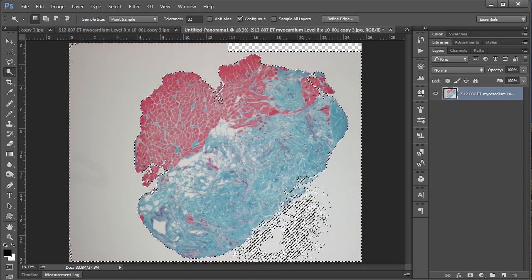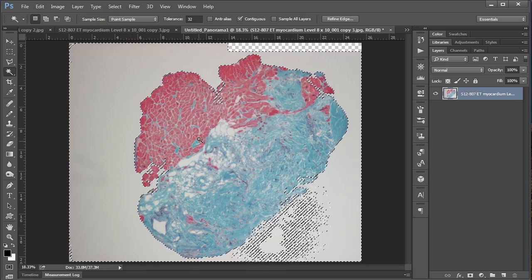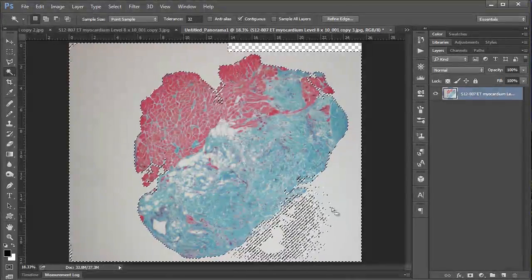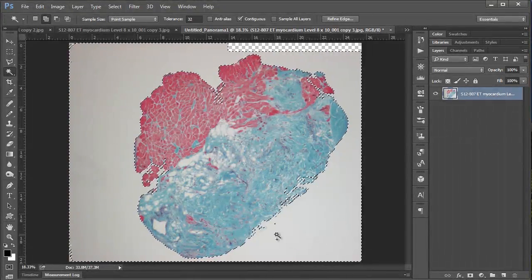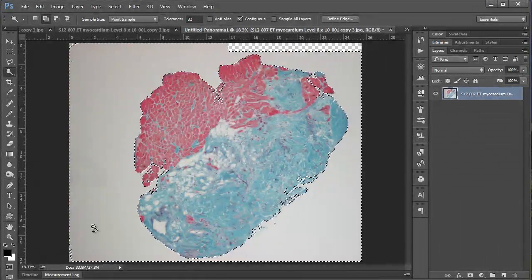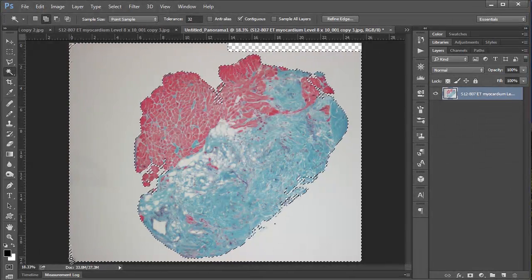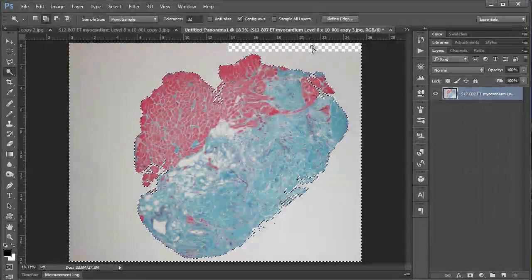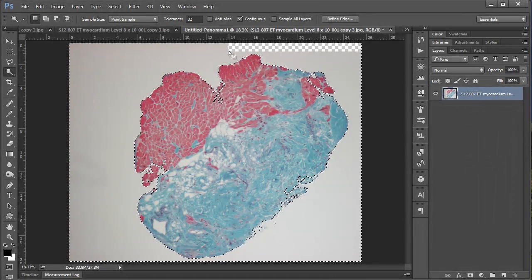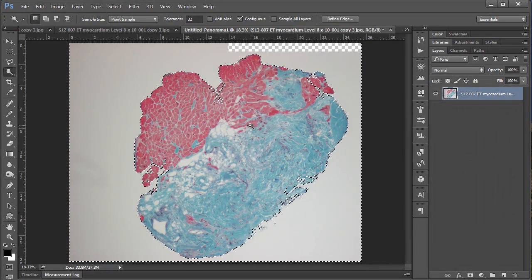But you can see there's some junk down here in this transparent area. So to add to that you hold the shift key and just click again in this area and you can see it's all added. So I'm just going to do that with these other areas, this corner here and the transparent area up here. And now I've got a selection that I'm pretty happy with.